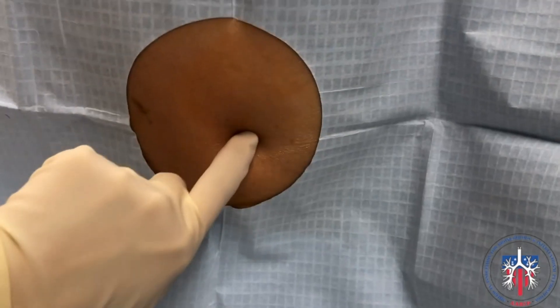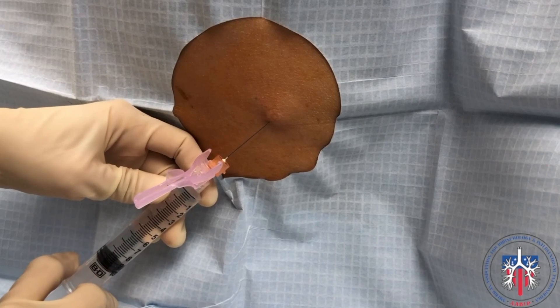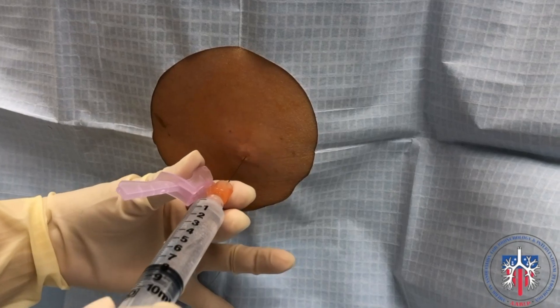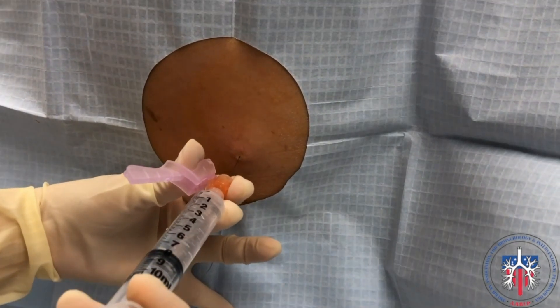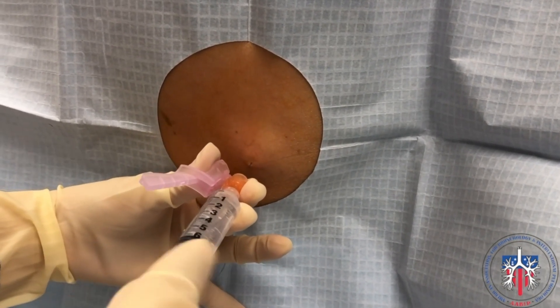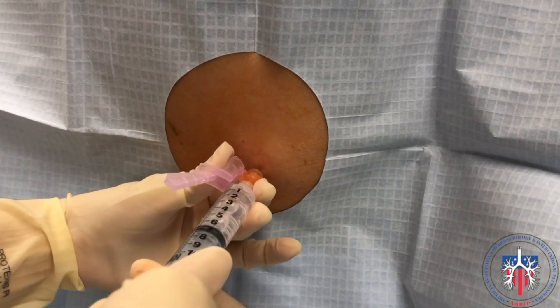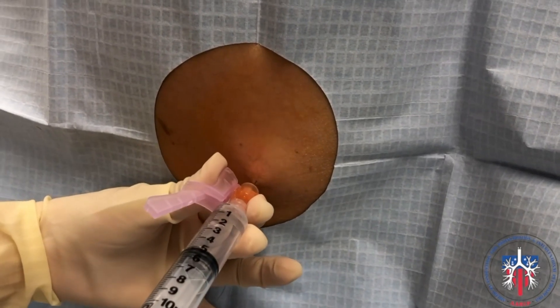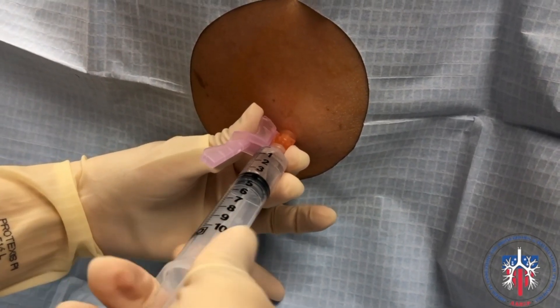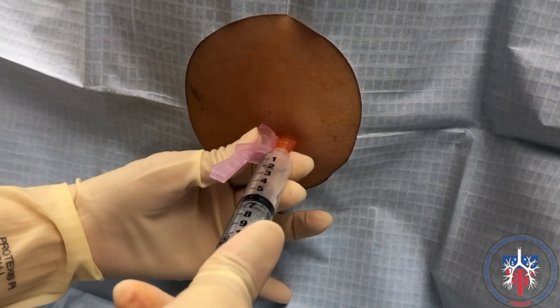Use a finger to feel the upper border of the rib one more time. Then inject lidocaine to anesthetize below the epidermis. After the skin is anesthetized at the superior aspect of the rib, slowly introduce the lidocaine needle little by little, about half a centimeter at a time. Inject lidocaine to anesthetize the subcutaneous tissue and the pleura. Keep the needle perpendicular to the rib. Always draw back before advancing the needle until pleural fluid flashback in the syringe is seen. Then inject more lidocaine after entering the pleural space close to the parietal pleura to numb the parietal pleura.